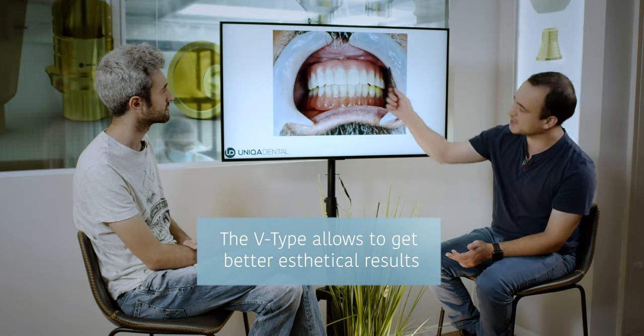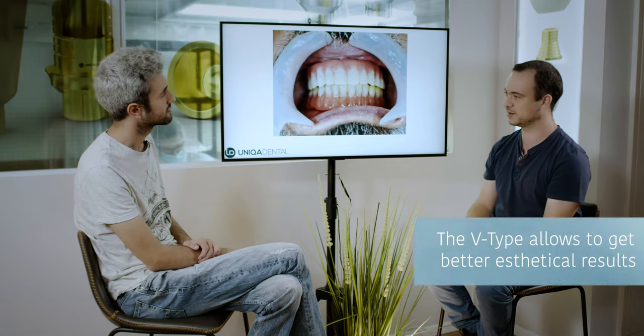In this case we use the small multi-units and not the big ones. The bar we'll be able to make will have very small pillars — small in height — and we can shift the main part of the bar more palatally, giving more space for the aesthetic part of the denture. Here you can see the end result: two dentures, upper and lower. You don't see any metal at all, no reflection of metal, because you have enough space for the plastic, for the opaque that masks the metal, for the teeth, for the gingiva.